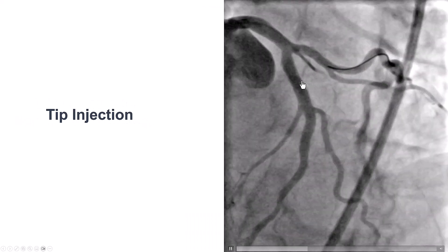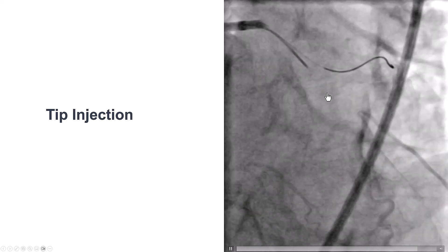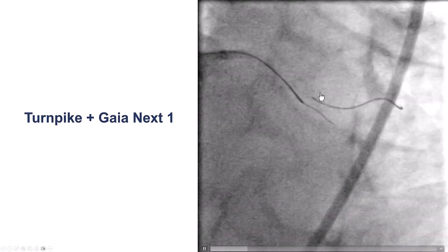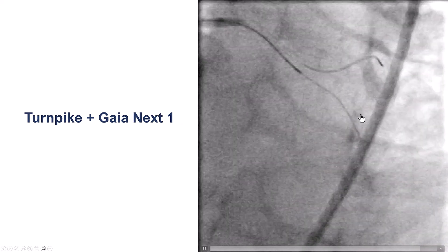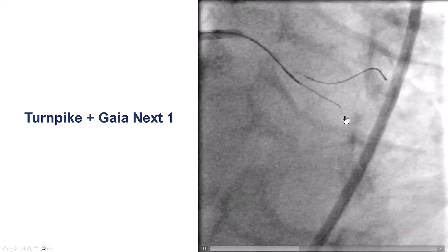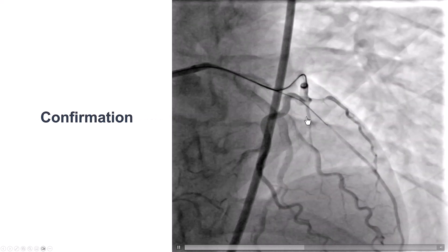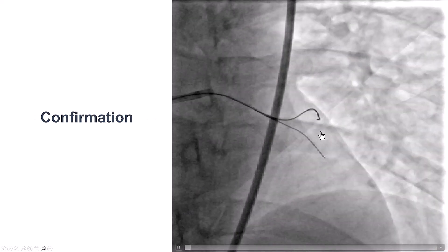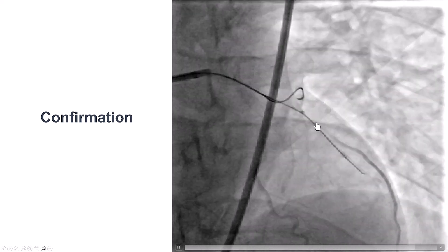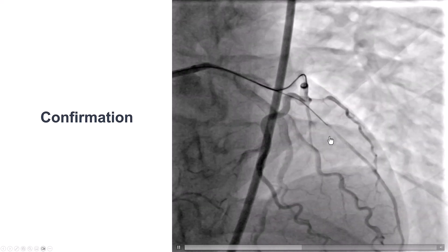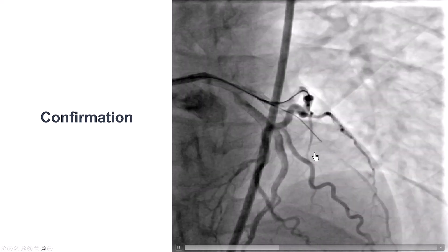We advanced a microcatheter and did a tip injection. There is a small branch that comes off at the proximal cap that makes engagement a little harder, so we decided to use a Gaia Next One wire, since we knew exactly where it was going. This wire actually easily moved along the course of the vessel and seems to be going in the right direction. This is confirmation through ipsilateral injection, and sure enough, the guide wire is inside the true lumen. One of the tips when performing that injection is to be ready to advance the guide wire to confirm that indeed it is moving within the lumen of the distal vessel.